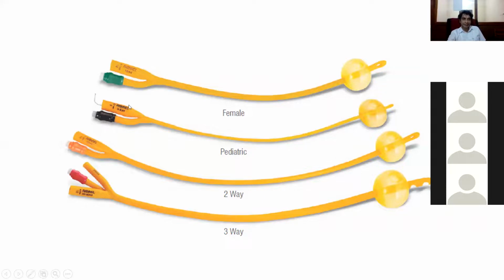And sometimes in children, in pediatric size catheters, to prevent the catheter from bending and making it difficult to insert, you have a little bit of plastic that goes through the catheter, which you have to take out once you insert the catheter, but it makes the catheter a bit stiff during the insertion. You call this a stylet, right? So stylets are sometimes put inside catheters to help them get inserted.